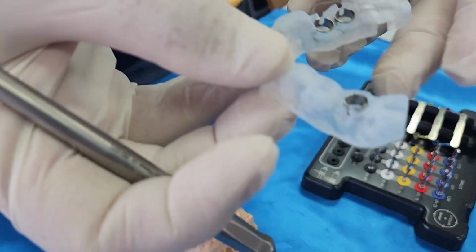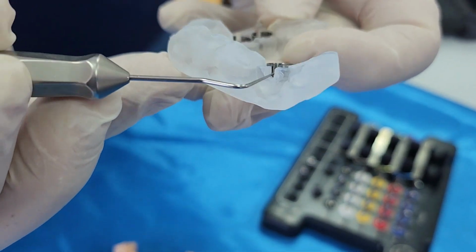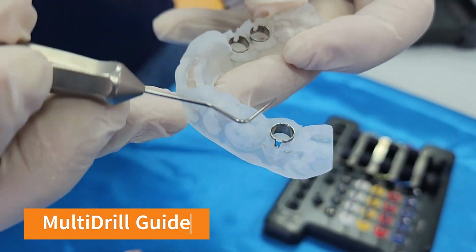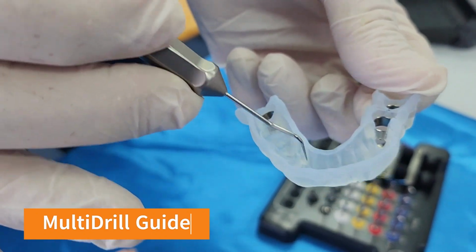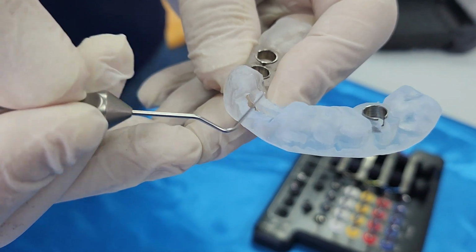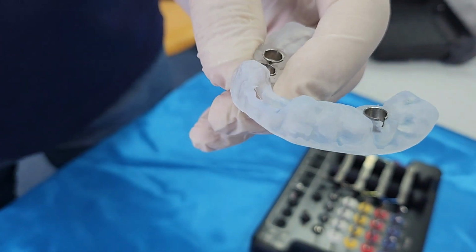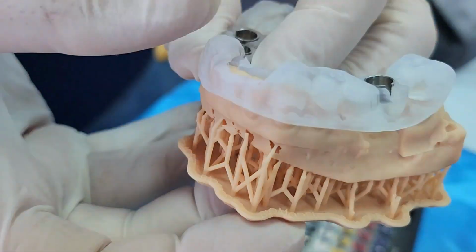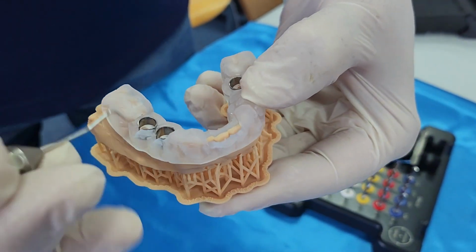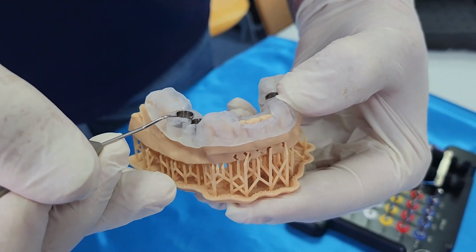Now, look at the guide. This is the surgical guide. The surgical guide is the fully surgical guide for the drills. You have the metal cylinders, you have the support on the existing teeth, and he's been making a hole here to check that you are in a fully down to the bottom position when you place the guide. So this is what we are going to do. We are going to show and place the guide in the exact right position. We can check here that we are fully down to the bottom, and we have the position of the drill.